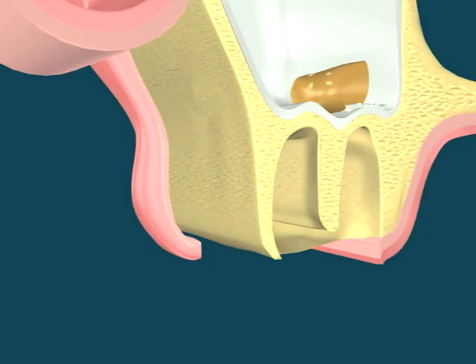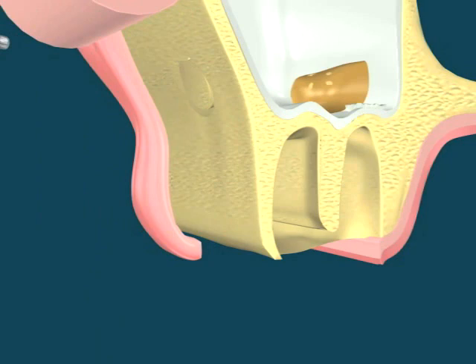The flaps are exposed. Access opening is made in the bone. Incision is made in sinus membrane.